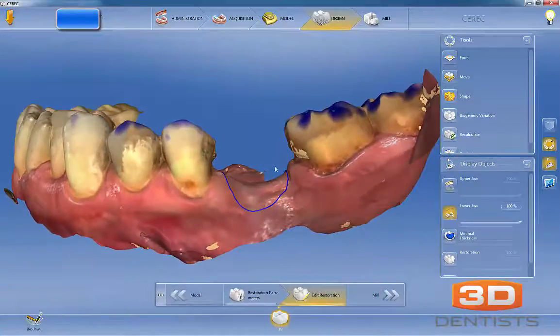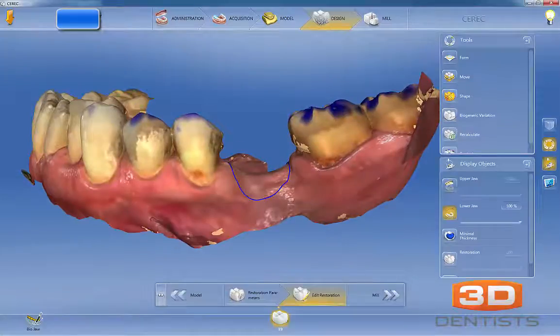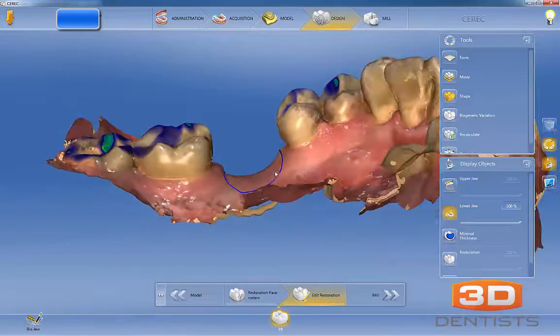And here we can see that the circle is drawn, but typically one of the mistakes is often it's not looked at from this perspective. So what I like to do is look at it from right here, and what I'll mentally do is draw out where this is, and from my perspective that margin line should be right here, not down here. So we need to get rid of that there.